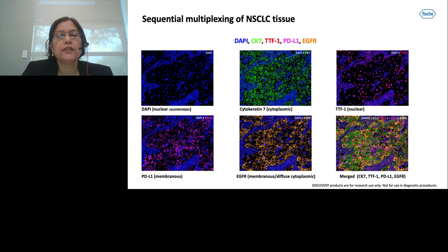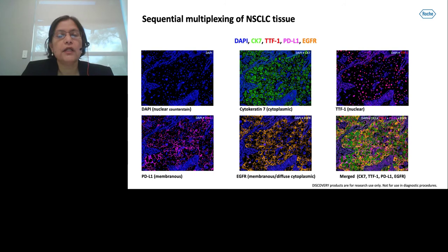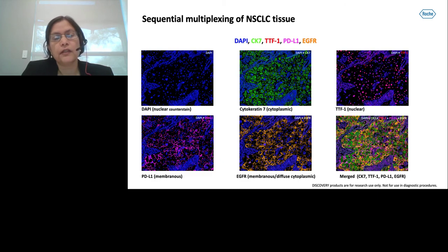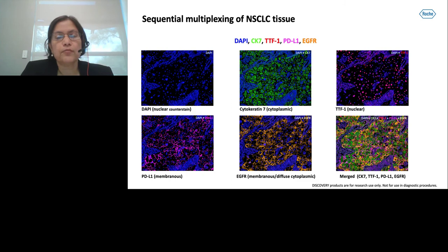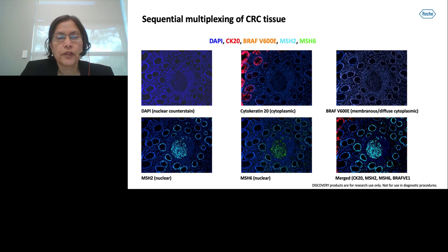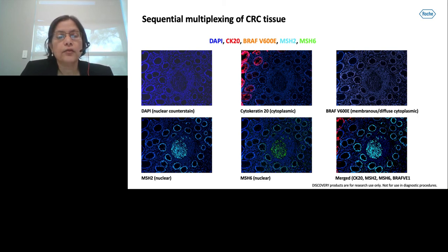Here is the sequential multiplexing of NSCLC tissue. You can see CK7 cytoplasmic staining, TTF1 nuclear staining, PDL1 membrane staining, and diffuse EGFR staining, and finally the merged image of NSCLC tissue. Here is a sequential multiplex stain of CRC tissue showing CK20 staining, very low BRAF V600E, and nuclear staining of MSH2 and MSH6, and finally the merged image.